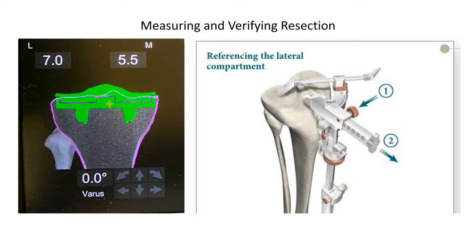This is our alignment rod from before. We put a finger and then this height is set to seven millimeters. So we estimate seven millimeters and then we make our cut. But we're unable to verify that this depth is seven millimeters. I'll show you the difference between being able to measure and set and then the difference when you can verify.